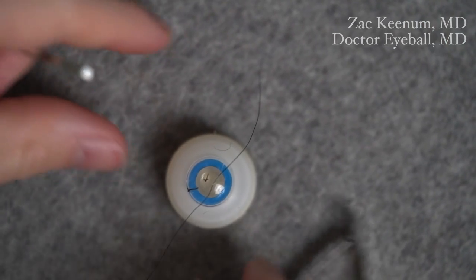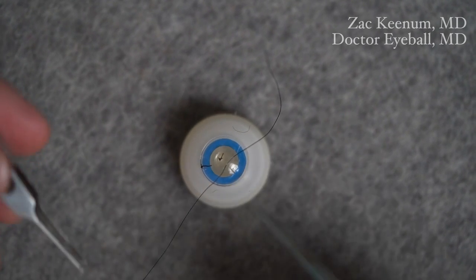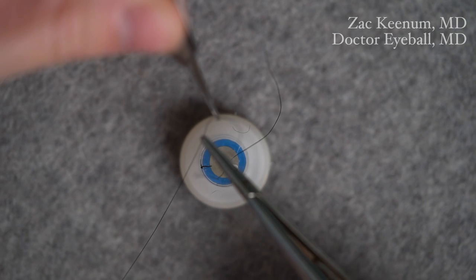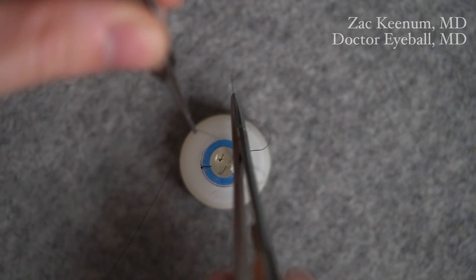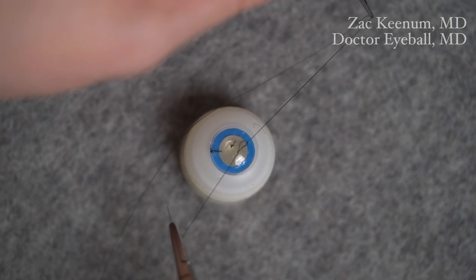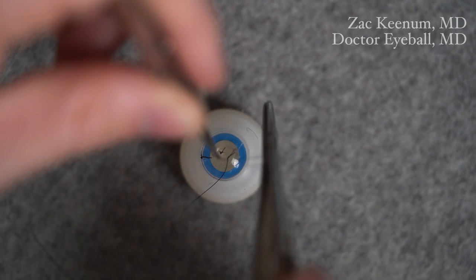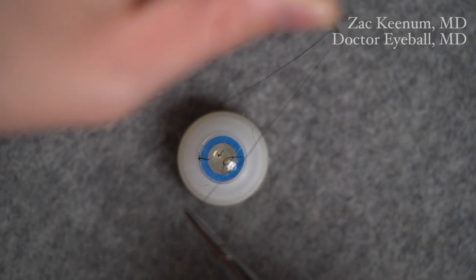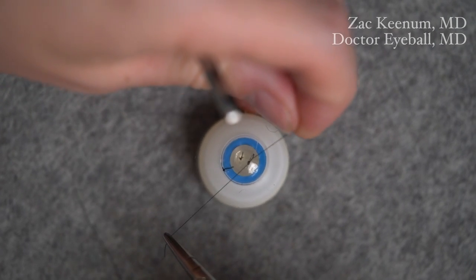Now I want to demonstrate how this might be used practically while closing an open globe. Say we've passed our suture. We start with the first throw, coming from within the loop, grab the short tail, and make sure to cross so that the first throw lays down flat. Then the second throw comes from behind the long stitch, sweeping under and around, grabbing the short stitch, not crossing, keeping the short arm on that side. Now we've created the slip knot.